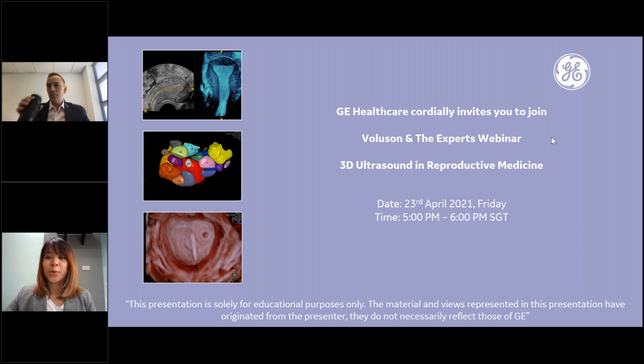Today, we have a very well-known speaker, Dr. Nicholas Fenning, who will be presenting on the topic of 3D ultrasound in reproductive medicine. This webinar session will cover how to get the best 2D image, how to acquire the best volume, and using the multiplanar view to standardize how to render and apply Omniview, including the automation tools for evaluating the volume of the ovary with SonoAVC.